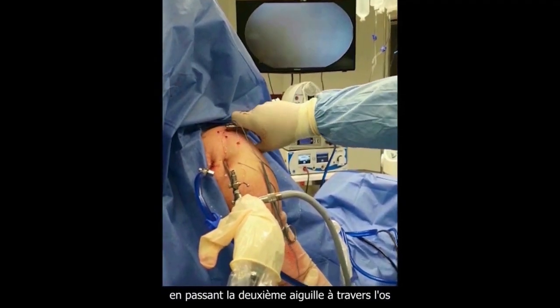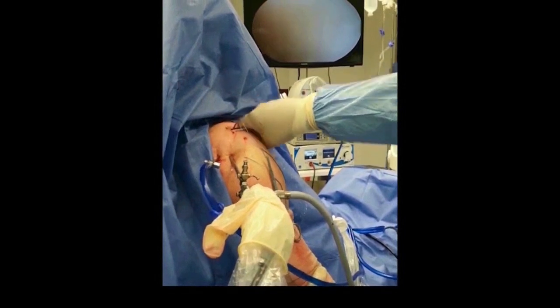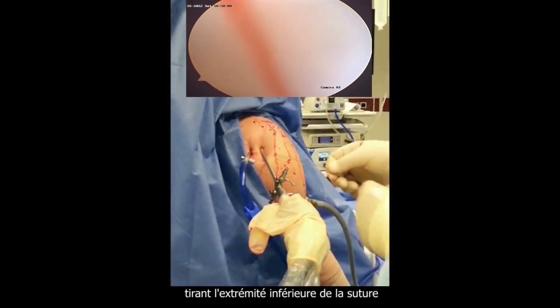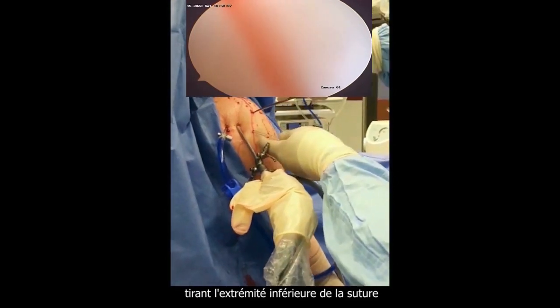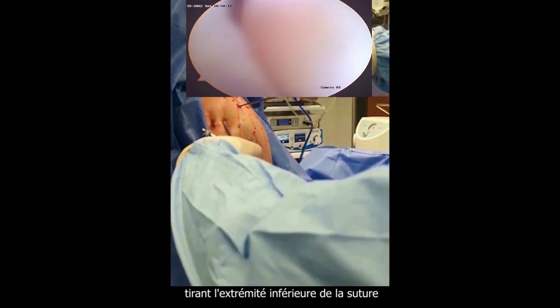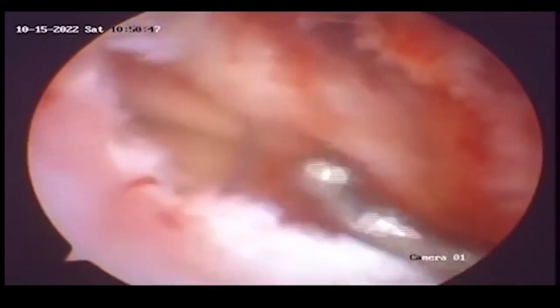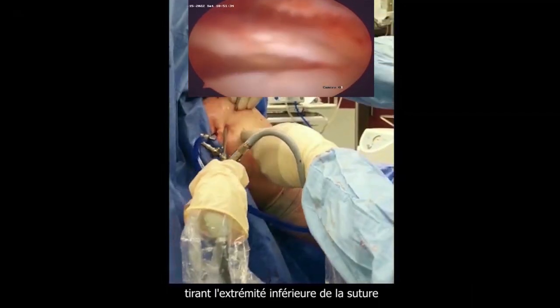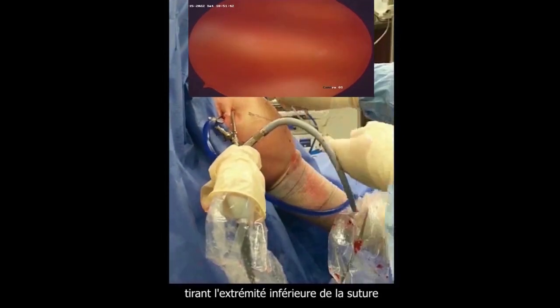The second needle now is pushed through the bone in a stepwise manner as the first one, and the upper ends of the sutures are held with a clamp. Now the lower ends of the suture are pulled out through the instrumentation portal using a hook by passing the hook down in contact with the shaft to avoid soft tissue impaction. You will see the hook going down, and then we feel the sutures by having them under tension with the left hand, and then they are pulled out through the instrumentation portal.